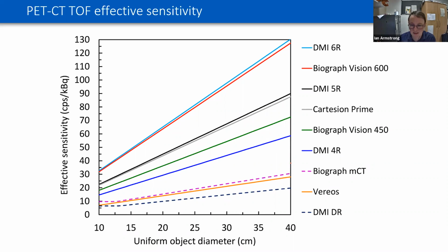One of the interesting things here is that a lot of the times you'll say, oh, well, digital is always better. But actually, we've got the 2 systems in the dashed lines at the bottom here based on the photomultiplier systems. And actually, if you have a very high intrinsic detector sensitivity, then you can still have pretty good performance from your system, which can be fairly comparable to some of the silicon photomultiplier systems, as we can see here.